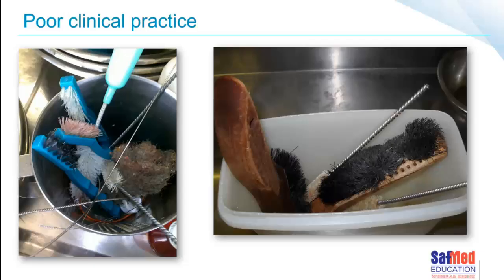And then we've got this jug container type thing on the left where all of our brushes are being stored, and in that you can see that they're not clean. You can see a standard domestic bottle brush for baby bottles. I hope that's not what they were cleaning here as well. We've got some steel wool in the mix and a whole bunch of, I don't know what else, maybe a Jacques catheter perhaps, not really sure. All sorts of odds and sods in this particular container. I hope that by now you're fully aware of the fact that this is really poor practice.